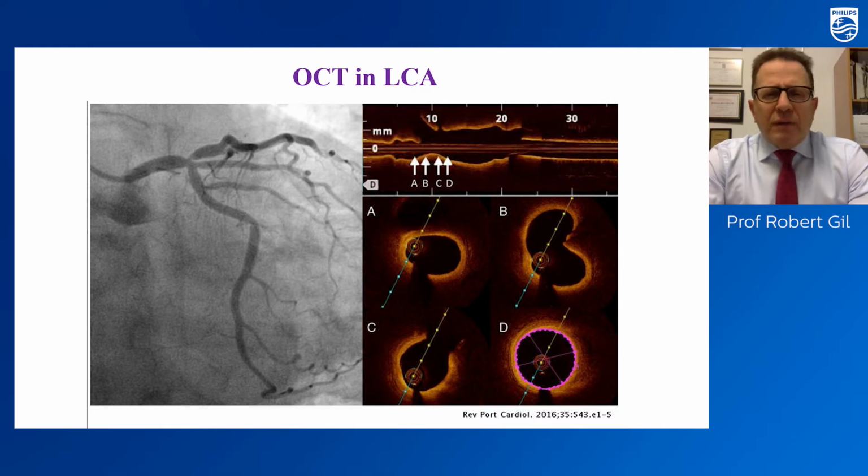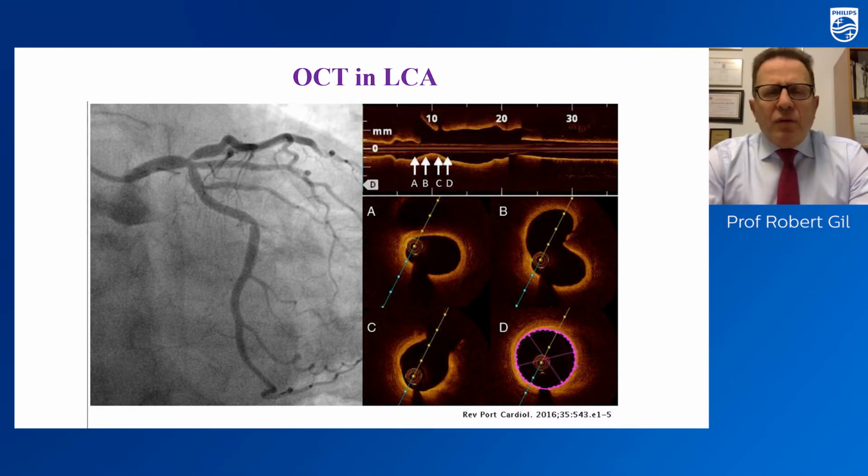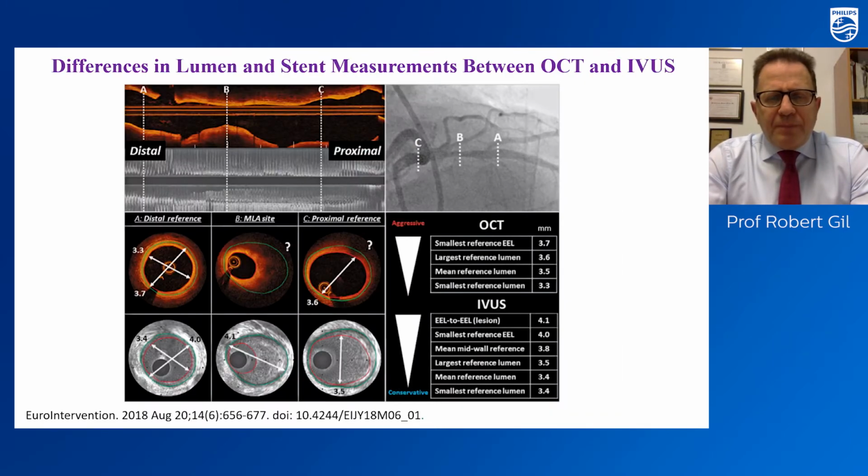especially when the entire left main is involved in stenosis, we have to distinguish whether IVUS is more appropriate in such a situation. However, with OCT, we can get really great pictures, like from an electron microscope.